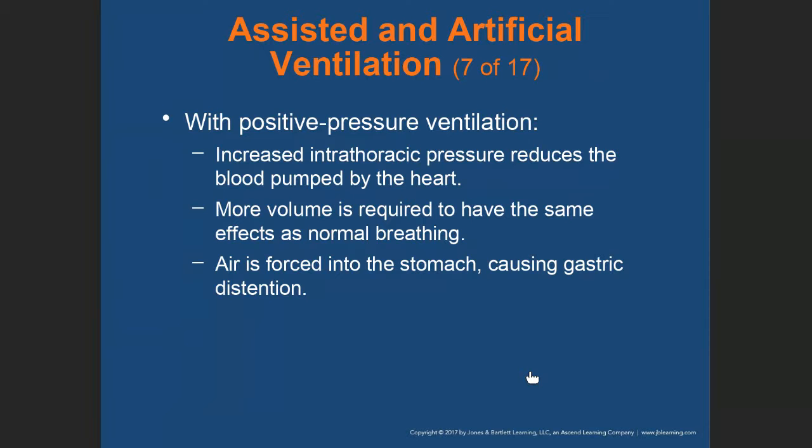There is increased pressure in the chest. So when you start to squeeze that BVM, you're going to feel resistance. And if you start to force when you feel that resistance, you're just going to make it worse. So it is very important that the proper technique is used.